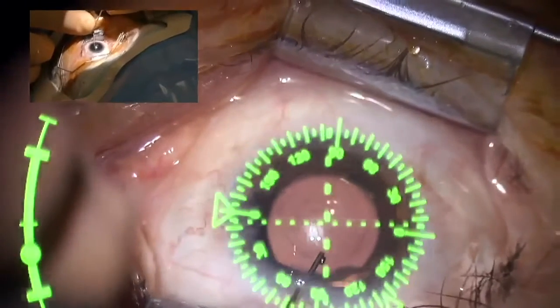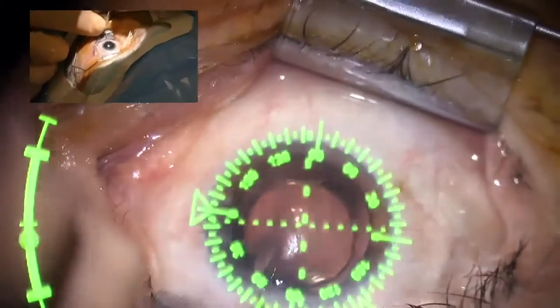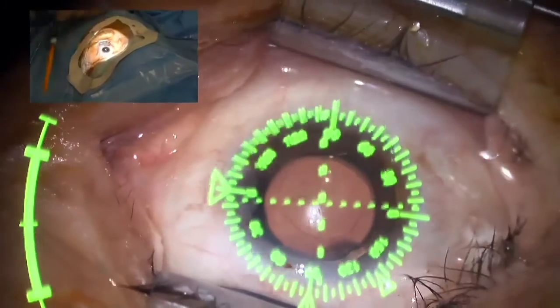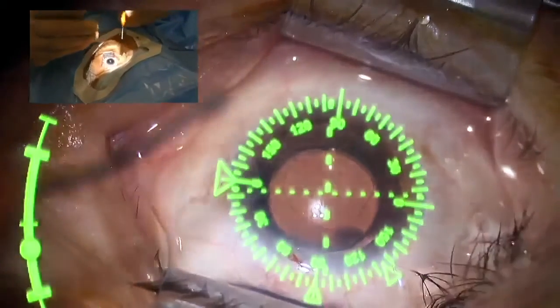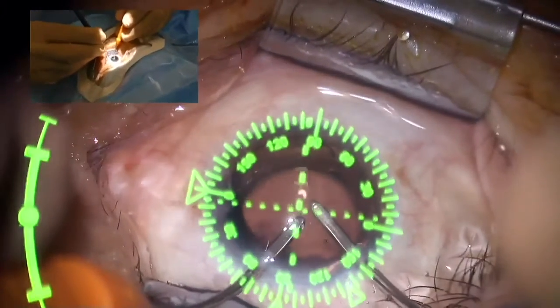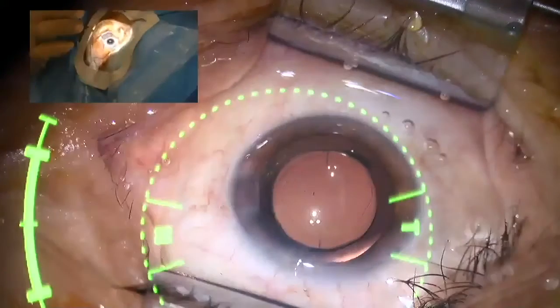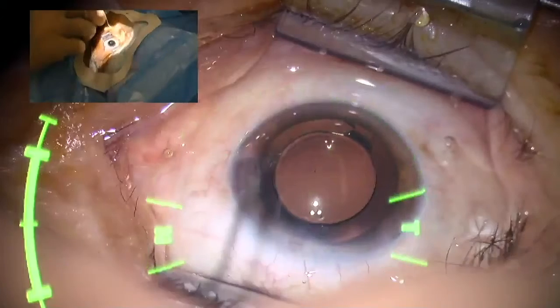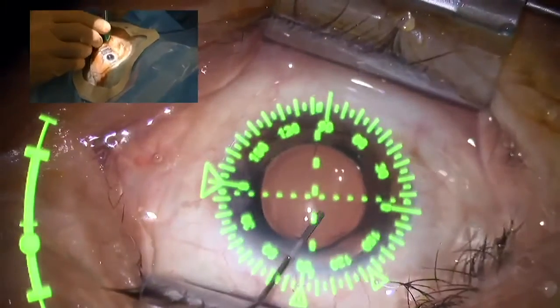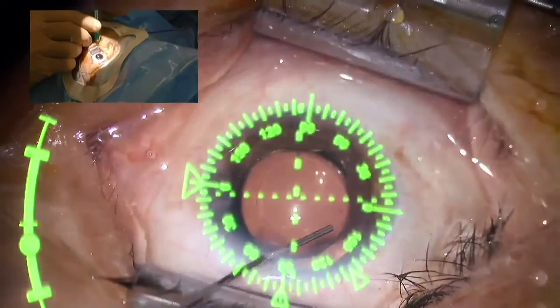After the implantation, normally when I only implant one toric IOL in the capsular bag, I would now remove the whole viscoelastic. Now I will do the same, just to have the bag clean with Healon. And now I fill the AC up again with Provisc and try to create more space between the iris back face and the capsular bag.